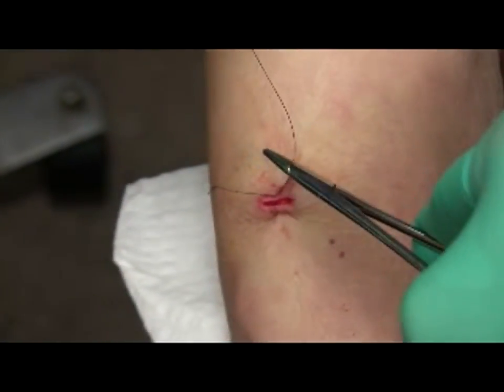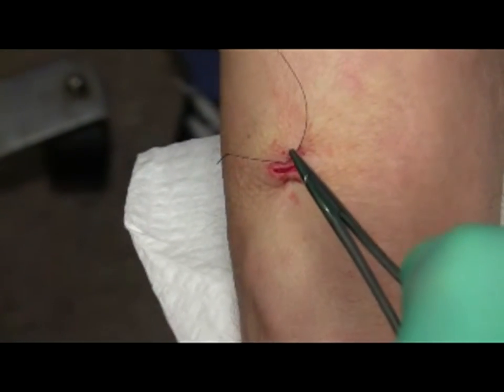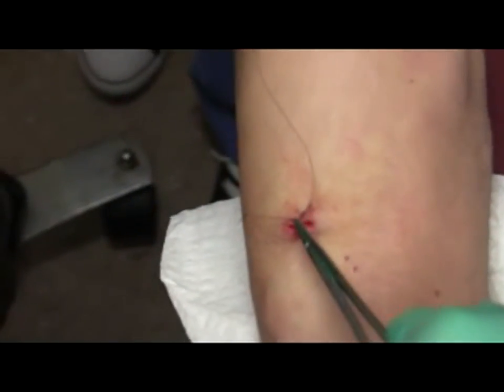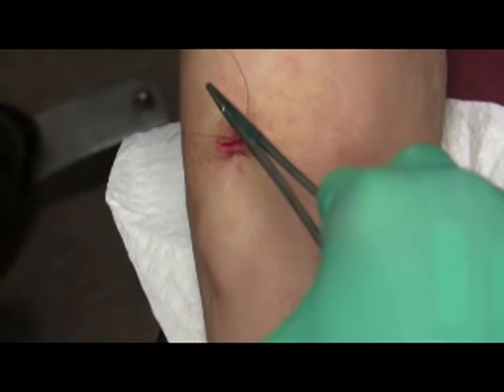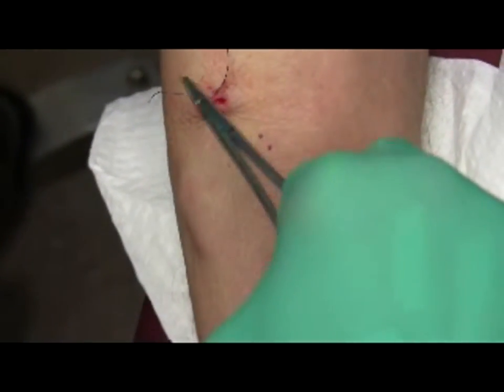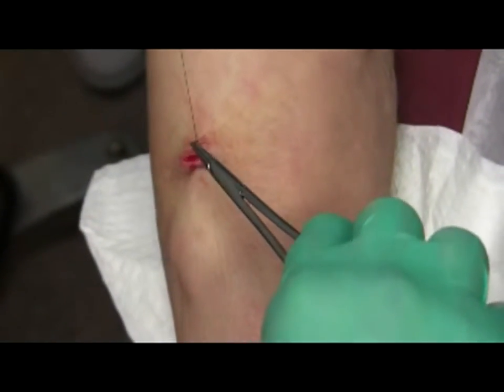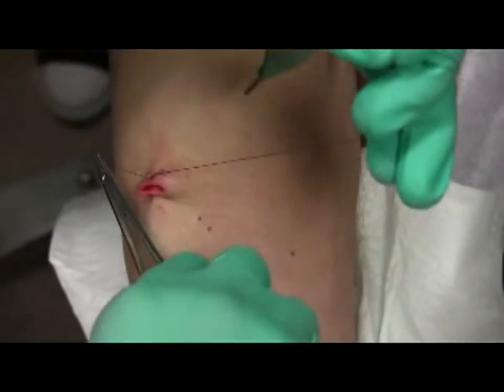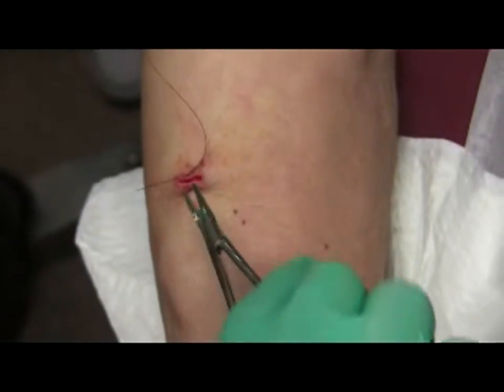You may see blood pooling in the wound defect while doing this. Before firmly tying the knot down, blot the pooled blood so the firm completion of the knot does not cause a splash. Immediately secure the knot after the blot before new blood can accumulate. If the wound does not appear to be closing readily, turn both hands 90 degrees such that the suture ends are perpendicular to the loop of the stitch — pulling the wound together much stronger.